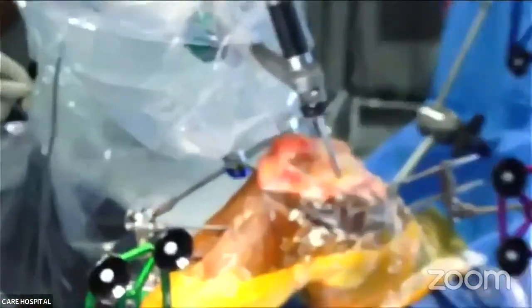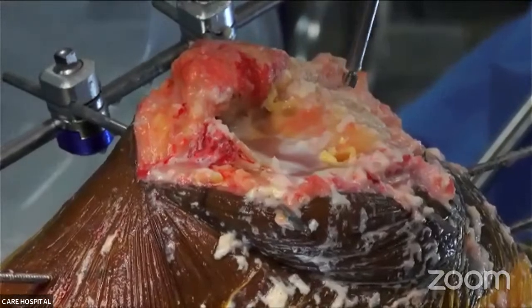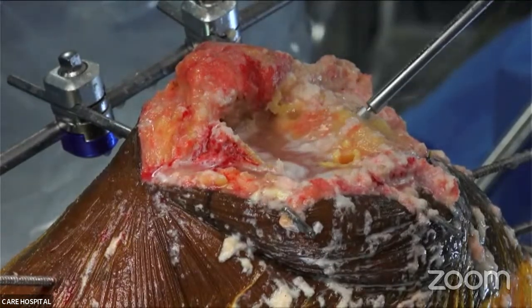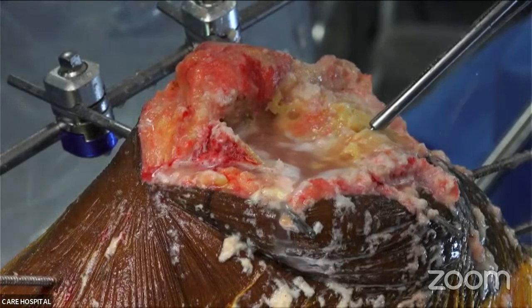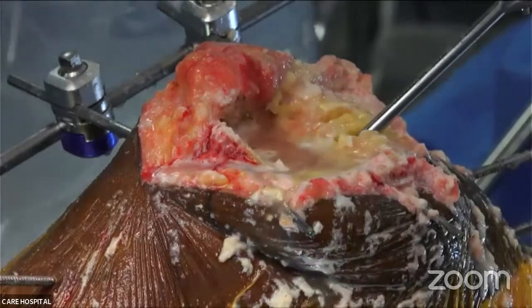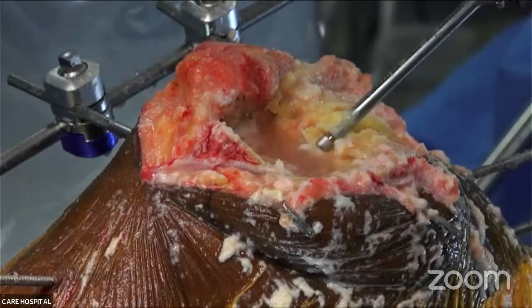Dr. Shekhar, have you decided on the sizing of the components? Yes. So the size is E. If during the gap balancing there was less flexion gap, maybe I could have downsized it. But since we balanced it quite okay, there was no need to change the size of the implant. And on the mediolateral aspect, we have already seen on the laptop screen that the size was okay. So this is the box cut which we are taking, as we will be doing a PS knee.